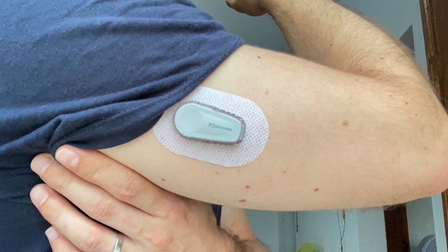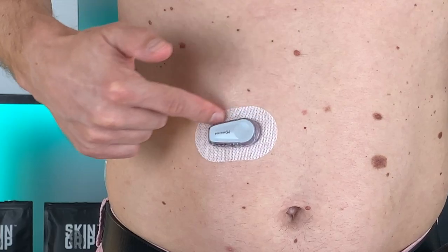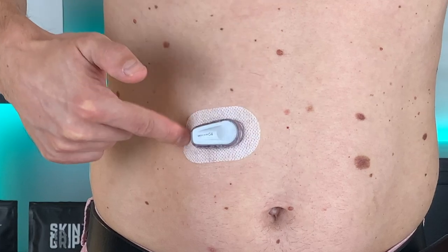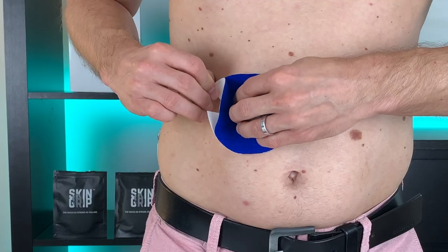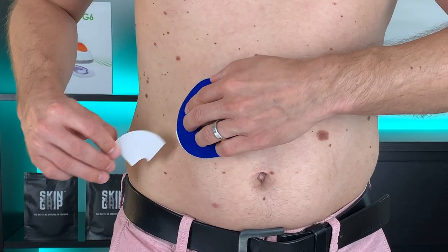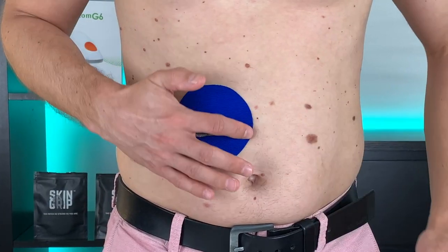The last thing that bothers me about the Dexcom design is the adhesive. It didn't irritate my skin, but it's supposed to last 10 days and it almost never does. Usually it starts peeling off after a few days, so I have to use an additional patch to keep the sensor on.